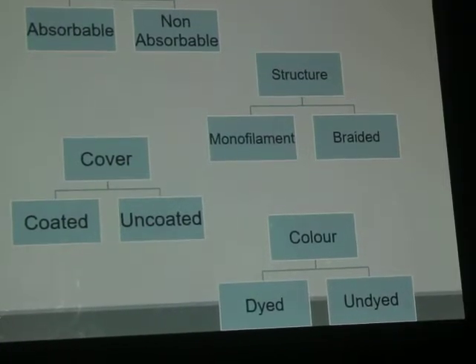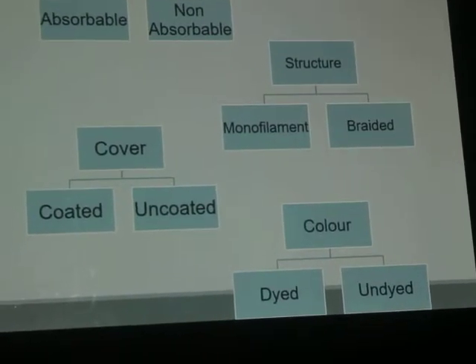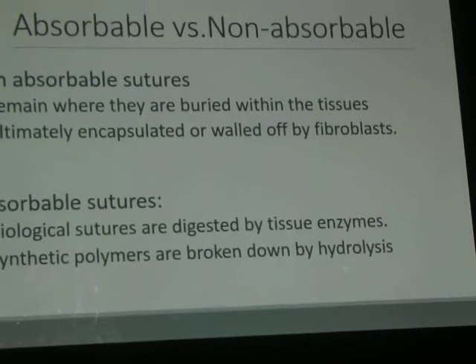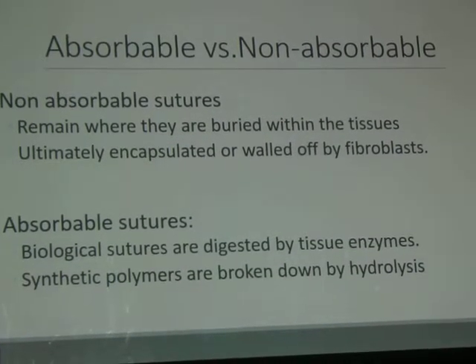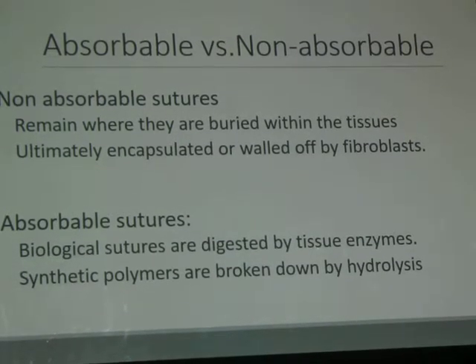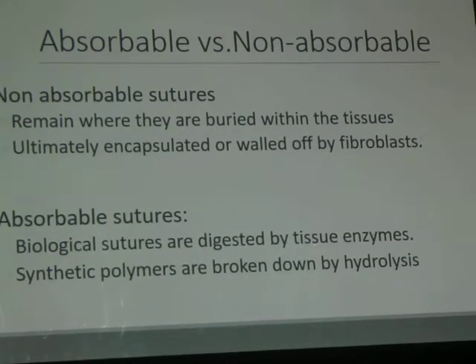فعشان كده أي suture material هنيجي نستخدمه لازم أبص على البروبرتيز دي كلها، بالإضافة للنيدل. دي حاجة ثانية، أنا بتكلم على الخيط لوحده دلوقتي. زي ما قلت لكم، الabsorbable والnon-absorbable: الnon-absorbable بتقعد في الجسم ولا بتدوب، والrate of dissolution will vary according to the type of suture. ولازم نبقى عارفين امتى الخيط ده هيمتص على حسب الrate of healing of tissue.